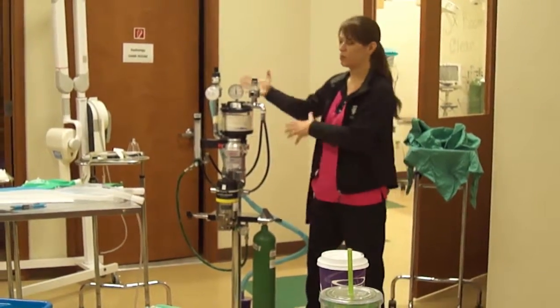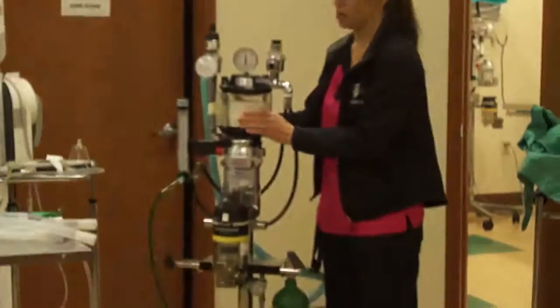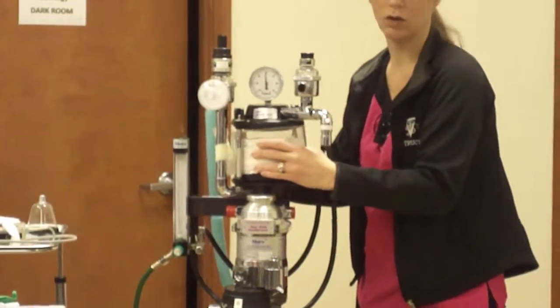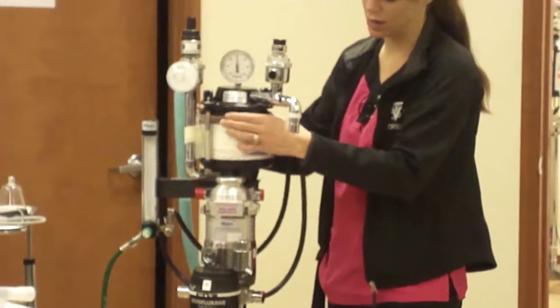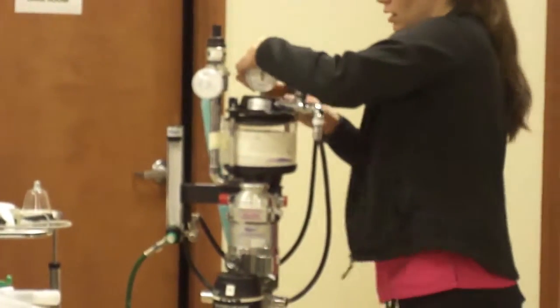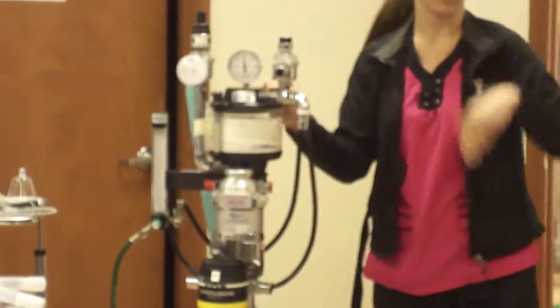To open this, I'm not going to pull it fully out, but there are these two little pop-off pieces here. You're just going to swivel it and then slide it out. Then you take it to the garbage, dump it as I told you to, fill it, and bring it back onto here. There we go. Press down on here, clamp, and you always, always, always want to make sure you pressure check your machine.